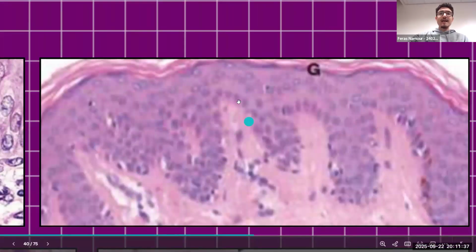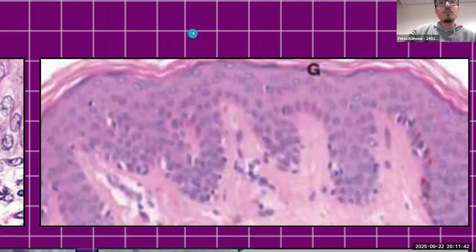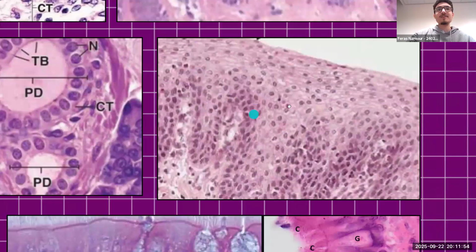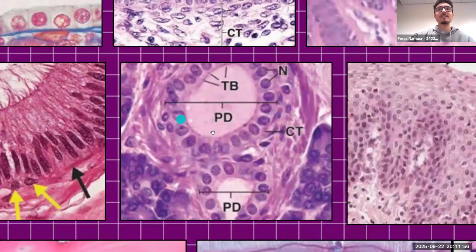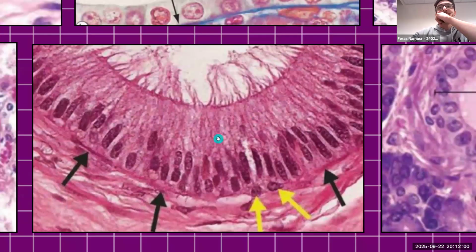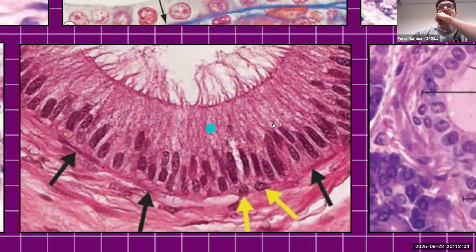This right here. I know the image is blurry, but yalla, guys. This is the basement membrane. Each single cell here is, whoa. MashaAllah, everyone is okay, everyone is replying. It's amazing. Alhamdulillah, okay. So stratified squamous. MashaAllah, okay, perfect. This is again stratified squamous. Yalla, this one, guys. What do you think this is? Stratified squamous keratinized. All right, that's a good guess for this one.